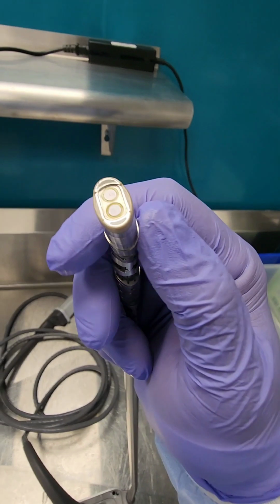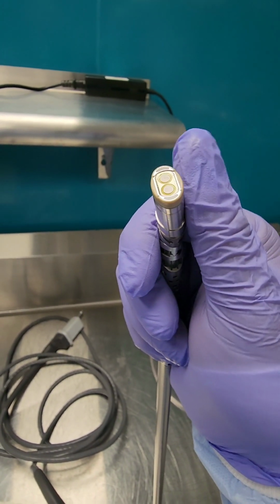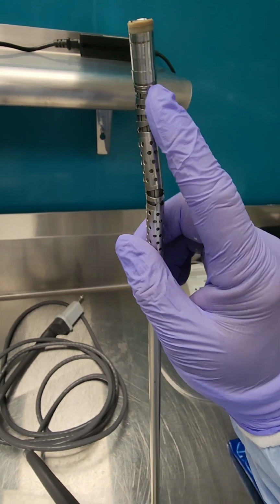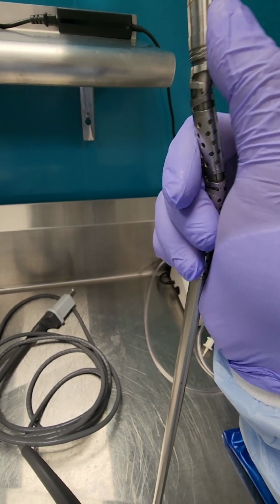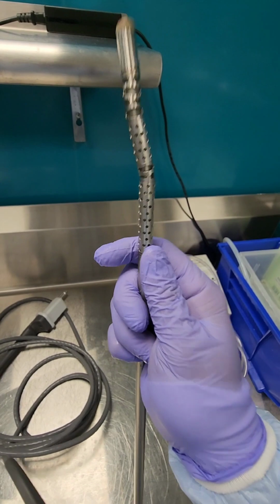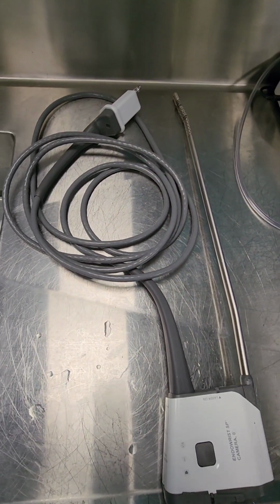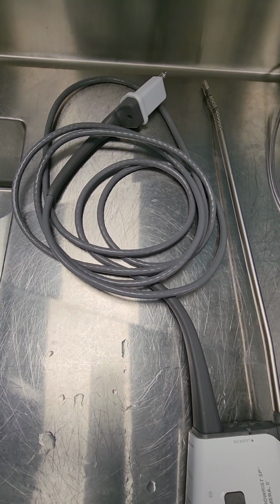So the IFU has you soak for 24 minutes, and then it has you wipe the lens for 60 seconds. And then after you wipe that lens for 60 seconds, you soak for another 4 minutes and then wipe again for another 60 seconds. After that, by my suggestion, you're going to flush your ports with detergent again, wipe off the exterior of the device, the cord, the connector, all those components of this device.